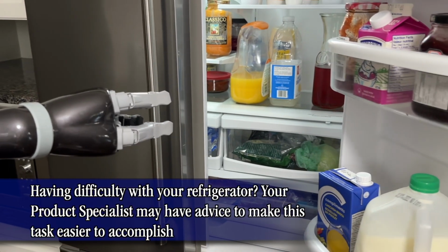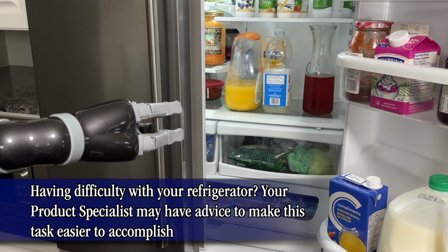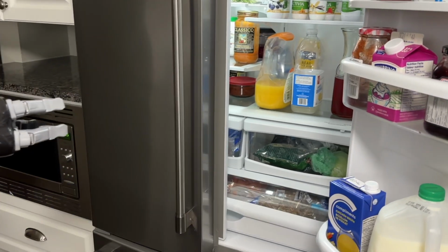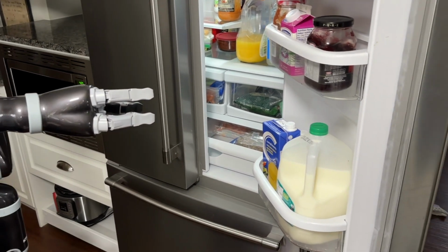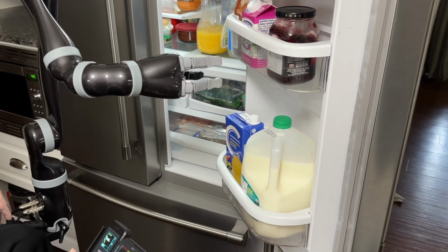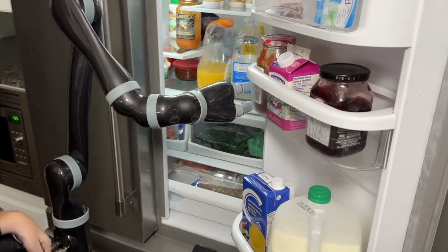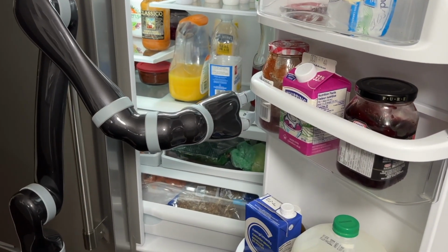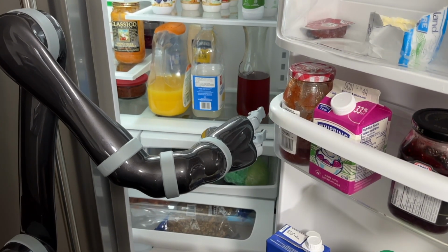Alright, now that the fridge is open, I'm going to use my power chair to reposition myself, which is something that's easy to overlook, but Jaco is part of a whole assistive technology setup that you've got, including your power chair. So make sure you use everything you've got to your advantage. So this is a good position here that I like, and I think I'm going to be able to grab what we're going for in here.